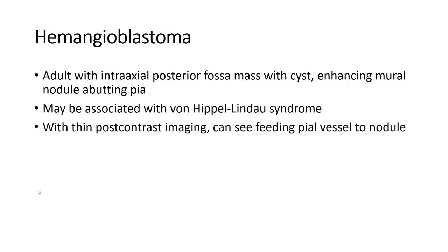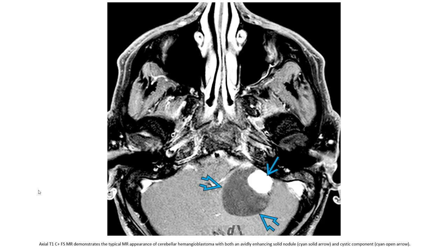Hemangioblastoma is an intra-axial posterior fossa mass with a cyst and enhancing mural nodule. It may be associated with Von Hippel-Lindau syndrome. On thin post-contrast imaging, one can see feeding vessels to the nodule. On axial T1C+, the classic pattern shows both the cyst component and the avidly enhancing solid nodule, indicated by the solid arrow.